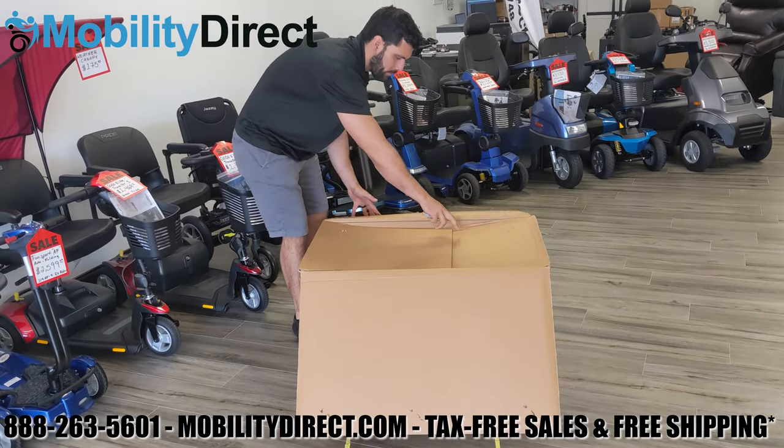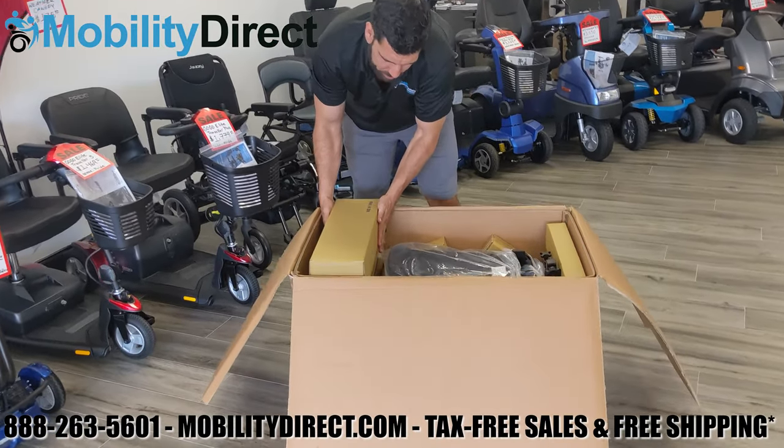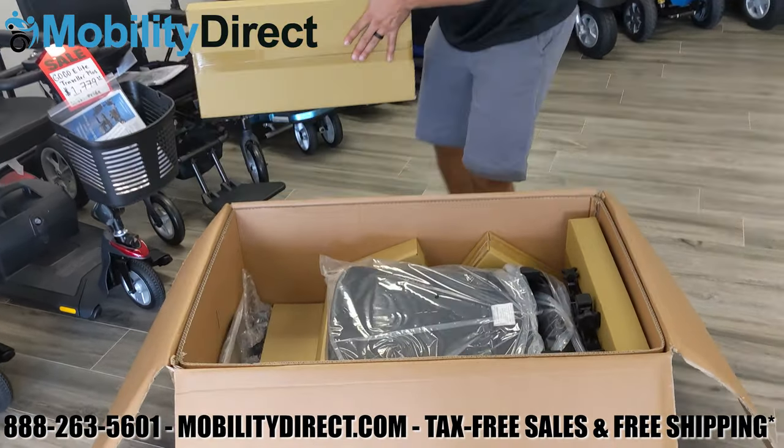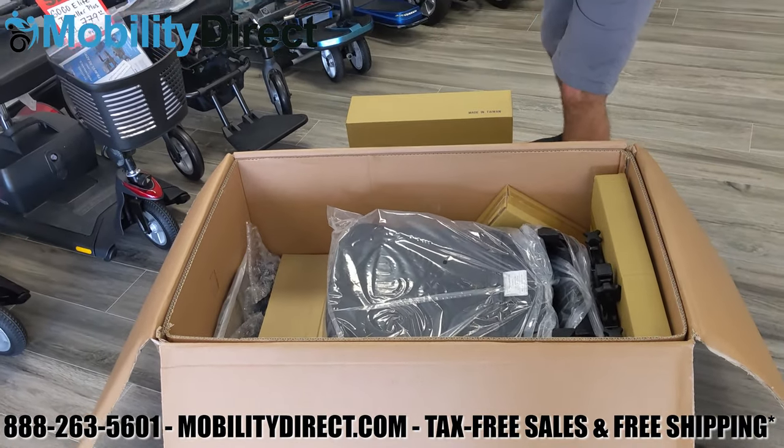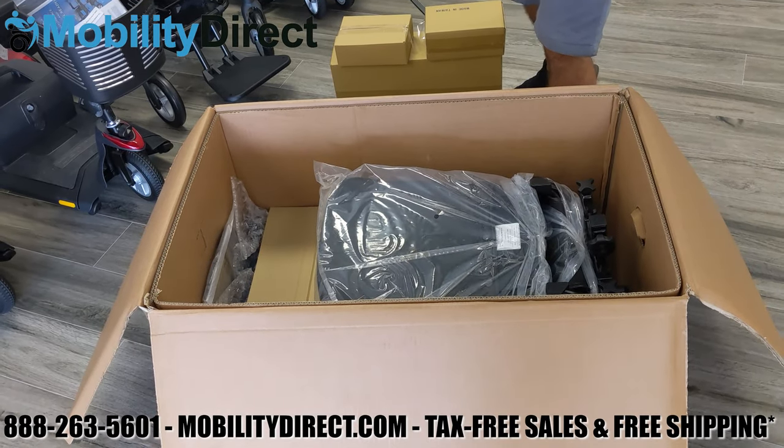Once you're done opening the lids of the box, you'll see that there are a lot of different boxes packaged up neatly. Go ahead and take out each box one at a time carefully and put them to the side. Be very careful with the box that contains the joystick controller, which has a metal pole sticking out of the box.